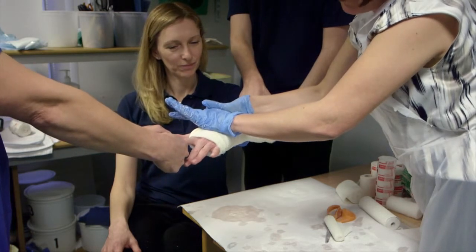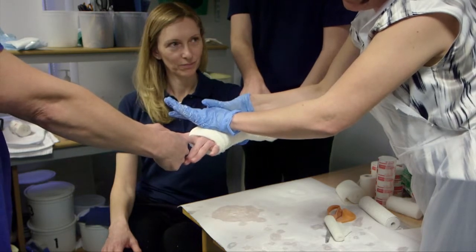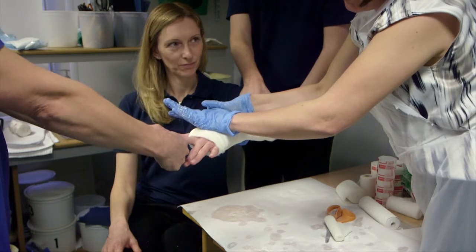You can see here I'm not flexing the wrist. We're not ulnar or radially deviating the wrist — it's just simple traction and it's that three-point moulding that will hold the radius.